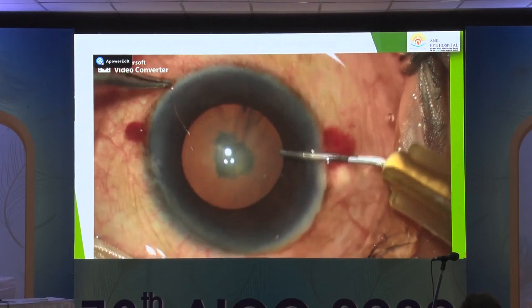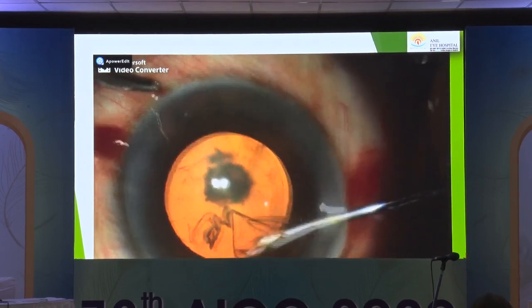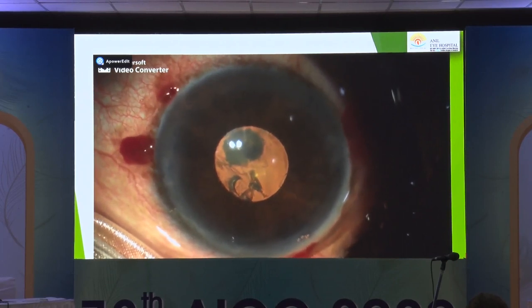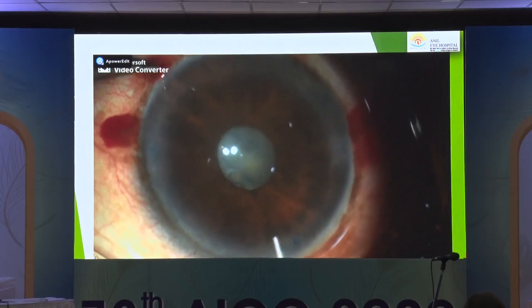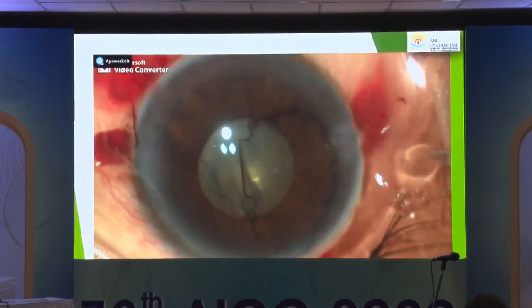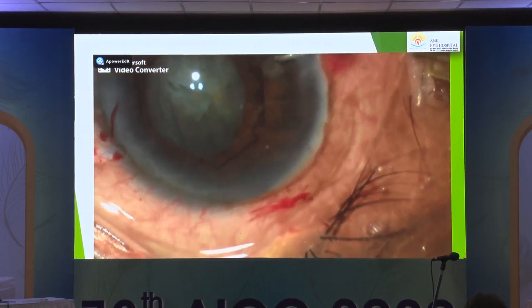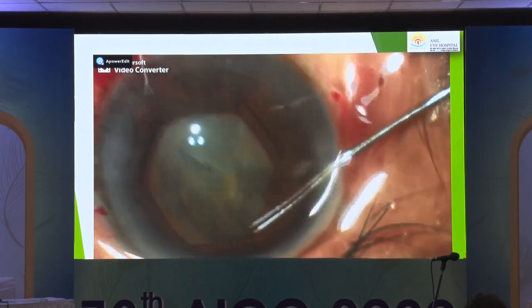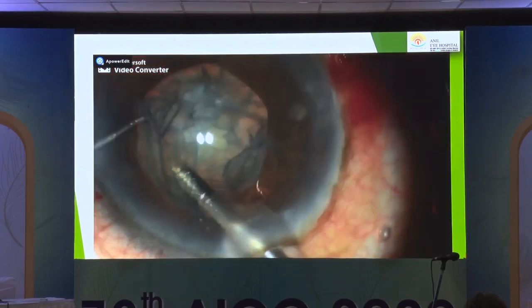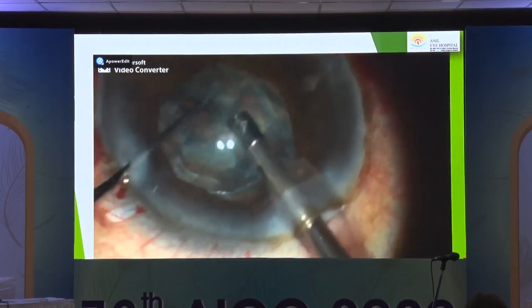An interesting patient presented with a well-dilated pupil so no pupillary expanding device was planned. However, once the rexis was done and before hydrodissection, the pupil started coming down for no reason — I thought the sister had given me pilocarpine instead of BSS. Even epinephrine did not expand the pupil at all. Since the rexis had already been done, we placed a B-Hex ring very gently, careful not to pull on the anterior capsular rim, and then went ahead with hydrodissection and the rest of the procedure.